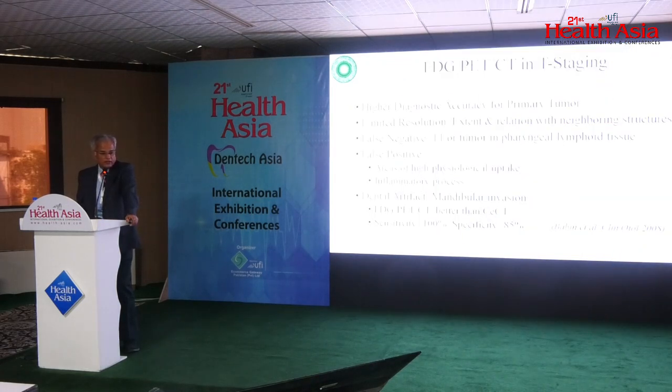As we know, the FDG PET-CT has higher diagnostic accuracy for the detection of the primary tumor, more than 90%. But because of its limited spatial resolution, it is not considered the modality of choice for T-staging, because its anatomical relation with the neighboring structures is not as precise as it is seen on MRI and contrast-enhanced CT. The false negative findings for T-staging are not uncommon, especially for small tumors and tumors which are lying in the pharyngeal lymphoid tissue.